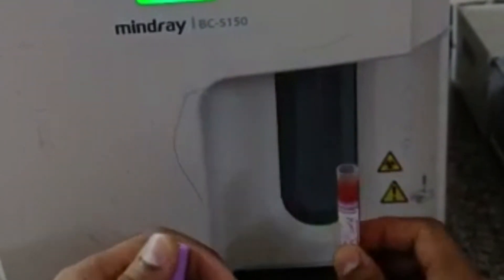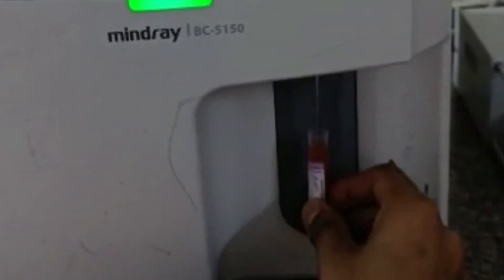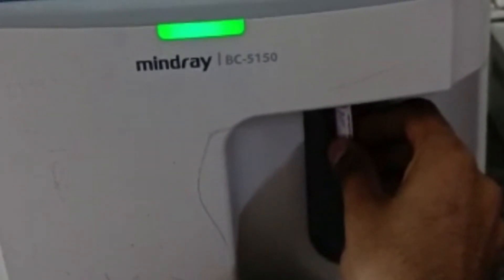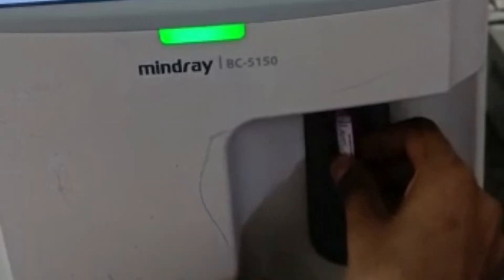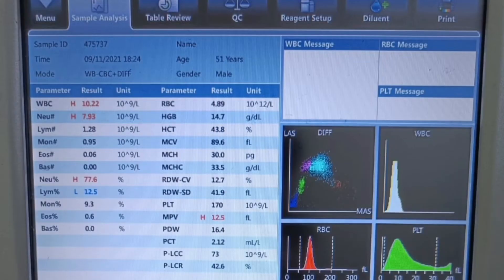Insert the probe in the EDTA sample vial and press the play button. The sampling probe aspirates the blood sample. CBC parameters results will be displayed on screen after a few seconds.